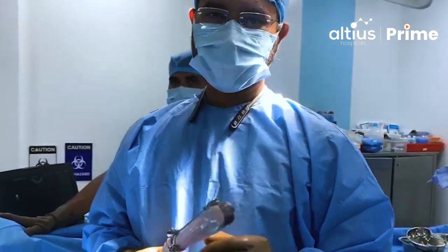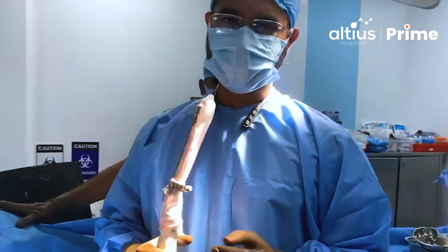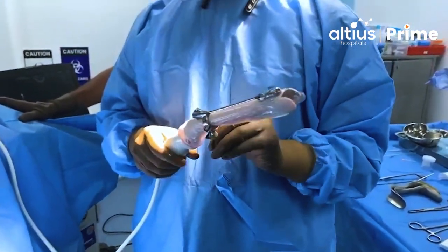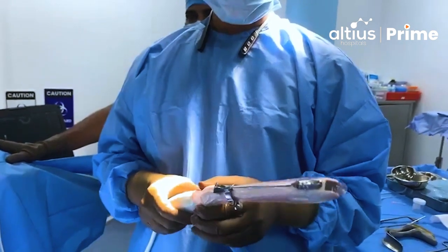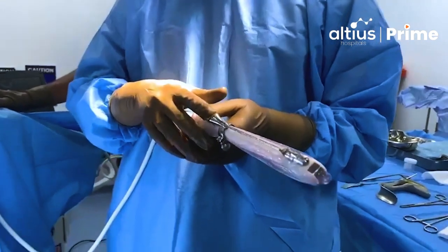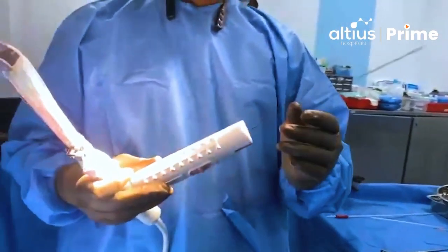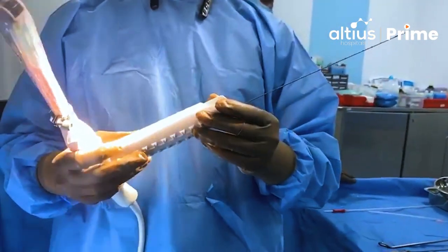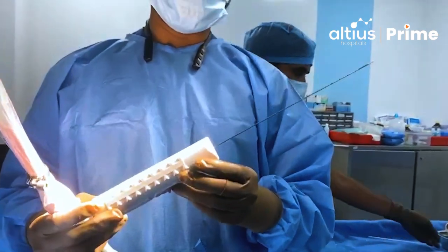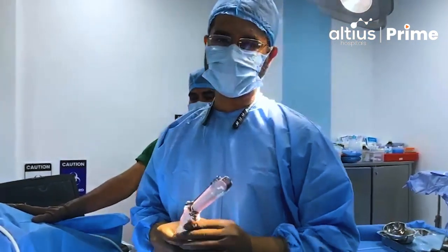The basic mandatory requirements for this procedure are: a transvaginal probe with dorsal tilt — 3D vaginal probes are not optimal for doing biopsies — a biopsy guide, which is an essential tool, and a long needle of at least 20 centimeters in length, 18 gauge or 16 gauge, to be utilized for biopsy.